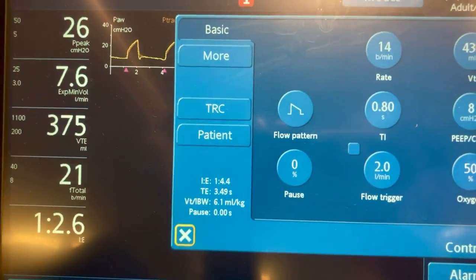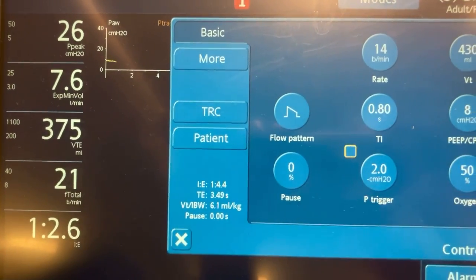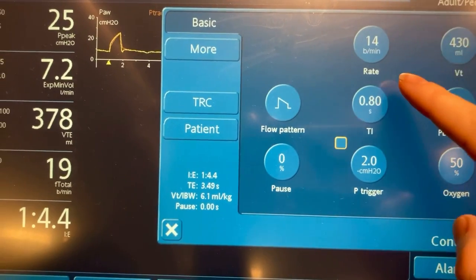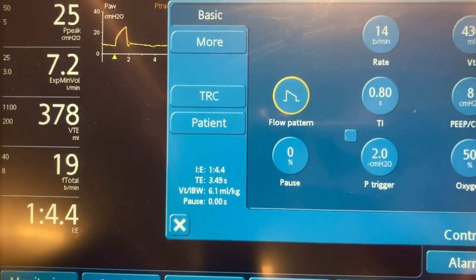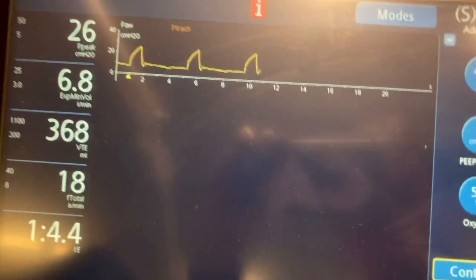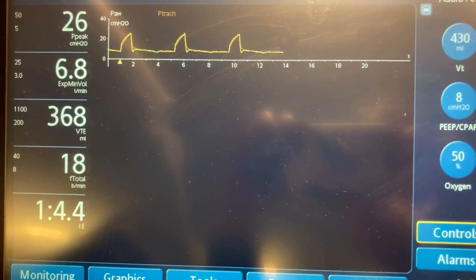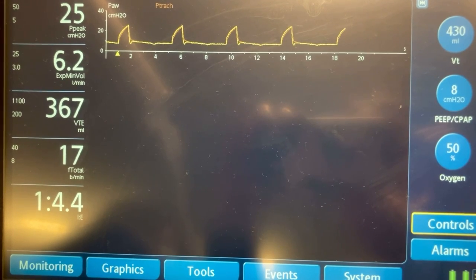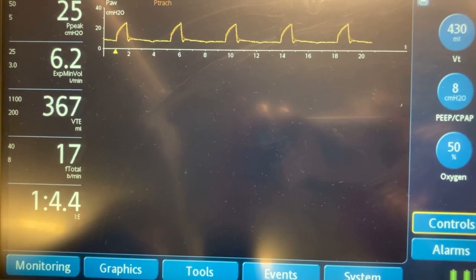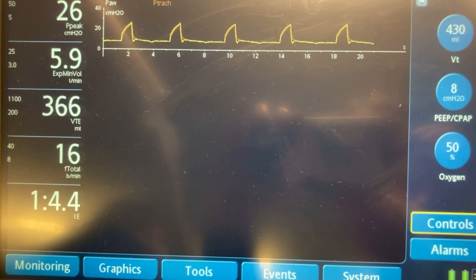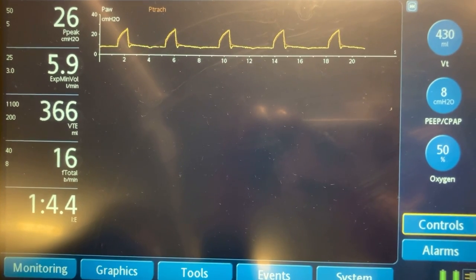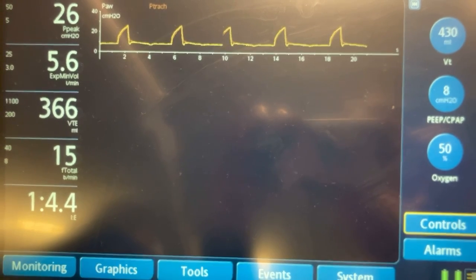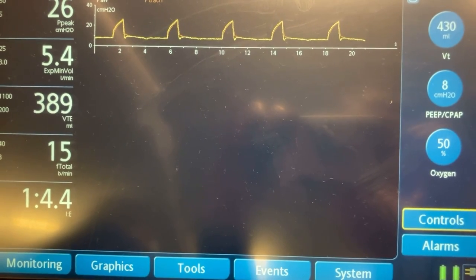To adjust for this, if I go back into the controls and change to a pressure trigger — still keeping the rate at 14 — going back into the ventilator, you can already see that there's more time between the breaths, and that the rate is dropping to actually match what we've set on the ventilator.